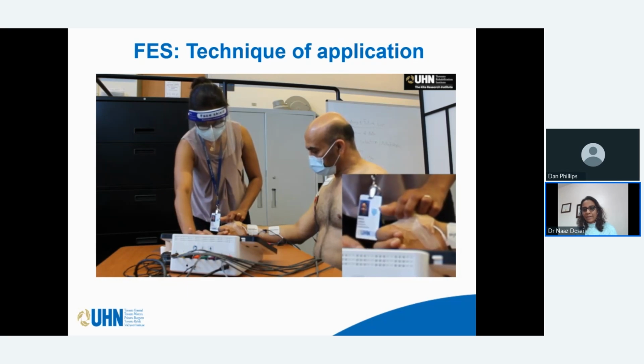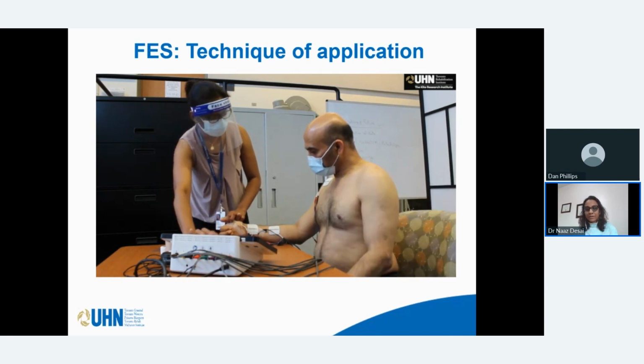And then, of course, throughout this process of setting amplitude, we are constantly asking for feedback from the patient because we want to make sure that the current is comfortable.